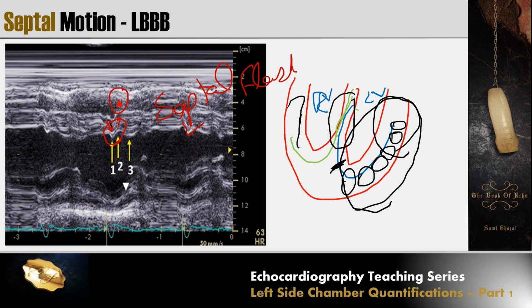We see it in left bundle branch block. And then it will go back here to normal when the lateral wall, the infralateral wall here, comes very late, and then the septum will come down here. So this is what you see in left bundle branch block.